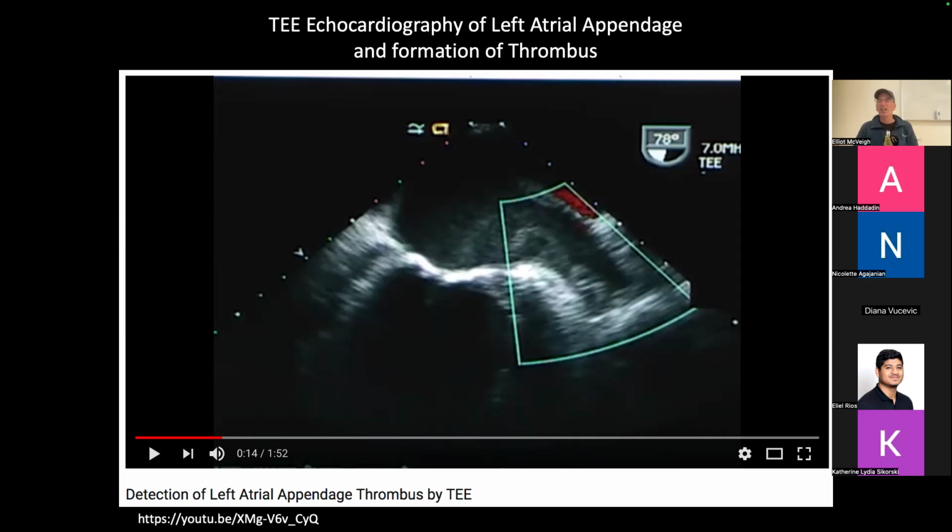So you say, oh, I don't think there's a clot in the left atrial appendage because your spatial resolution isn't enough, your time resolution isn't enough, or whatever. And then they defibrillate that patient and they have a stroke. Okay. Huge sort of penalty for a false negative there.